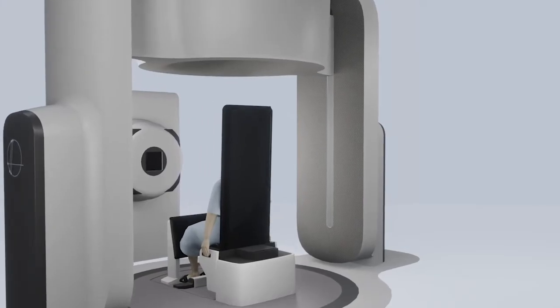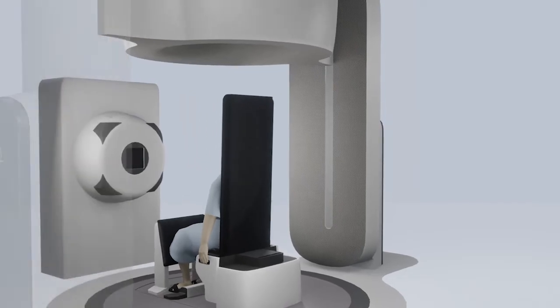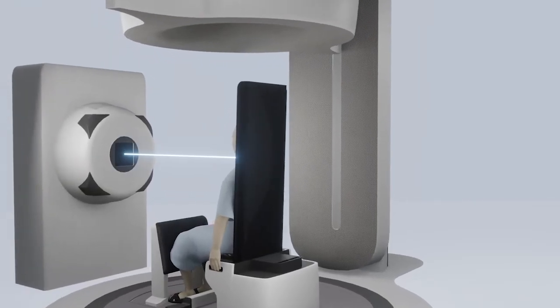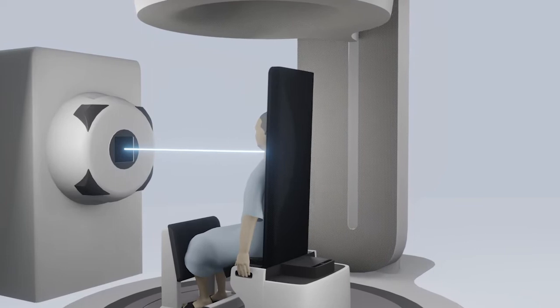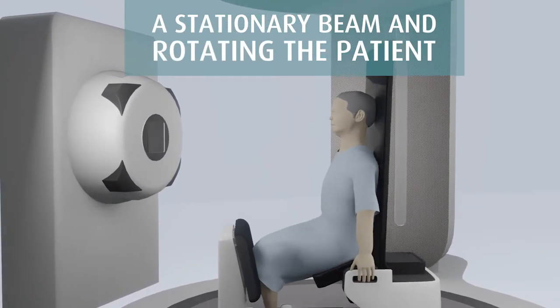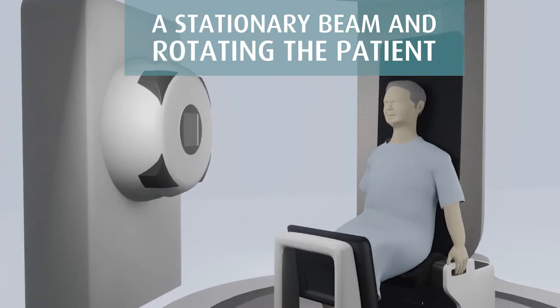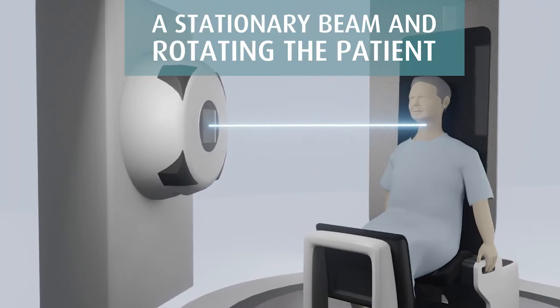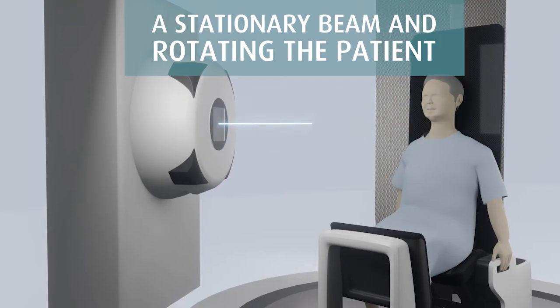We agree radiation beams need to be delivered from different angles, but we remove the need for a gantry by using a stationary beam and rotating the patient to improve reliability and ISO center accuracy, whilst reducing both equipment and maintenance costs.